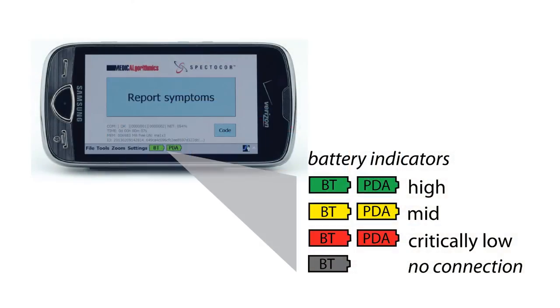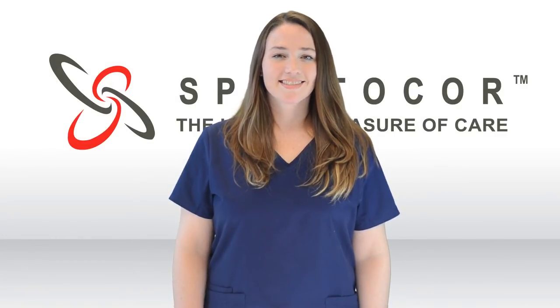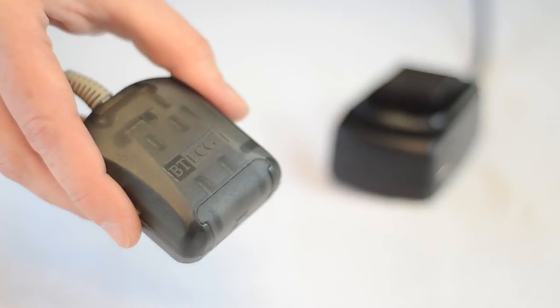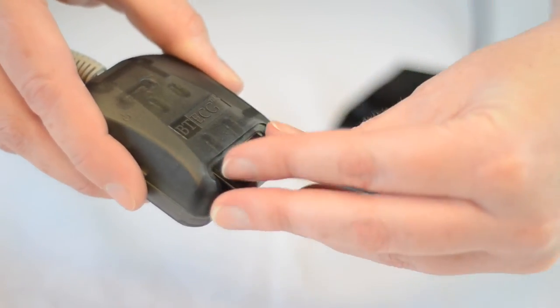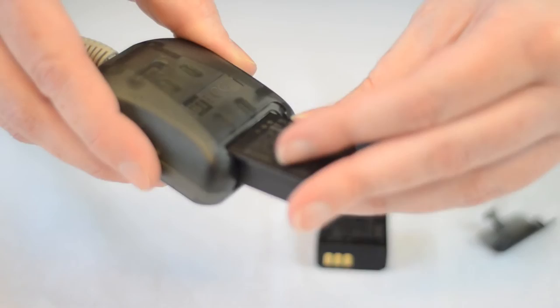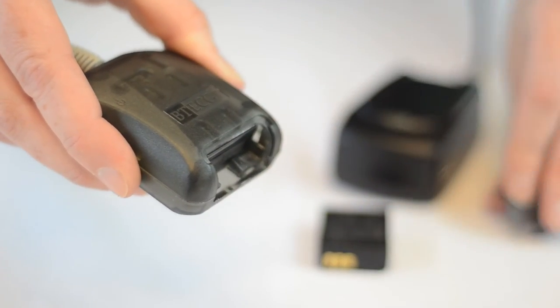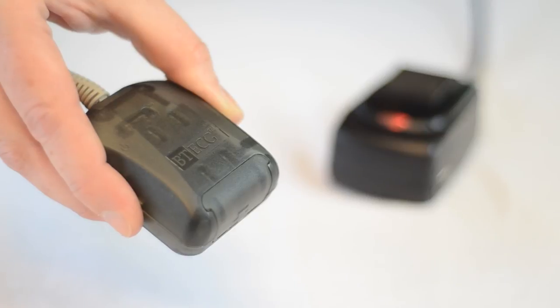You can check your battery levels by looking at the bottom of the PDA screen. Change the heart monitor battery twice a day. Remove the battery cover from the heart monitor, press the release lever and remove the battery, then insert a fresh battery and replace the heart monitor battery cover. Put the discharged battery into the charger — when the red light turns green, the battery is fully charged.